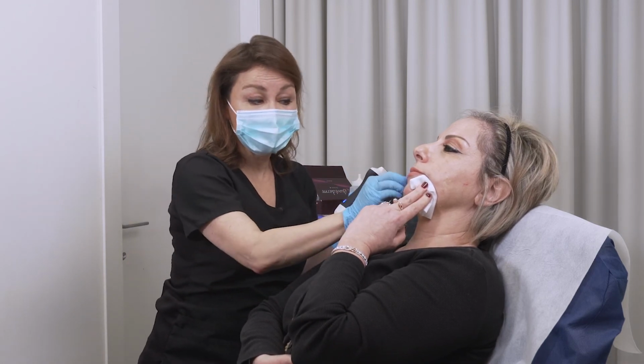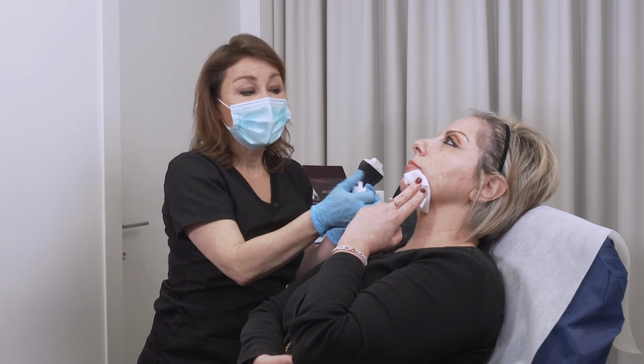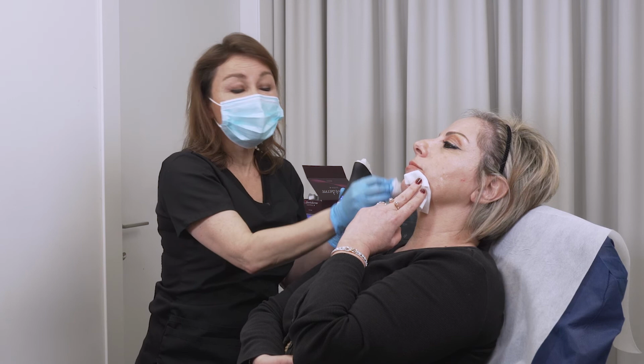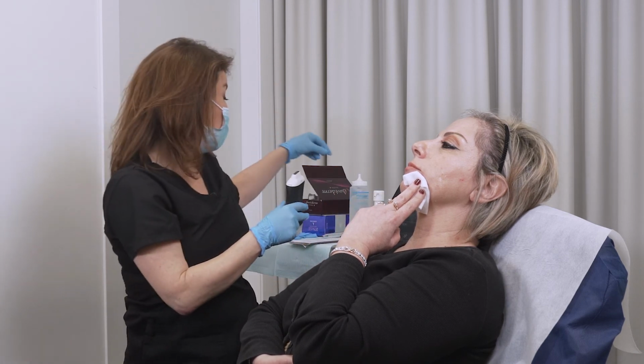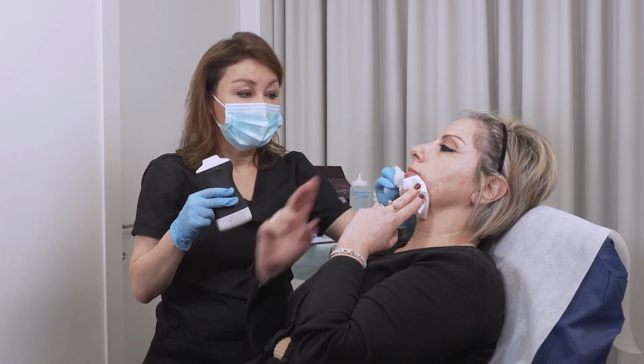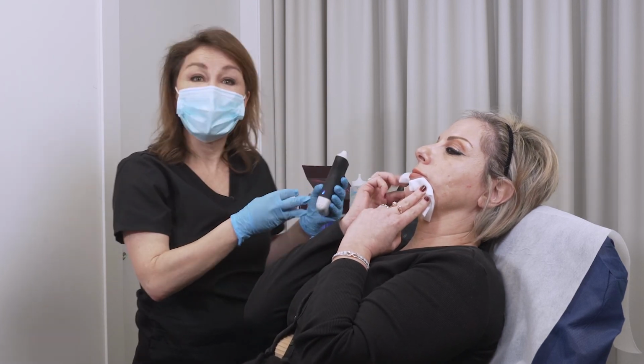So we injected into the marionette line, and we didn't obstruct or hit any vessel. Also, there is no hematoma and nothing there, because we actually injected not at the area where the bigger vessels are.